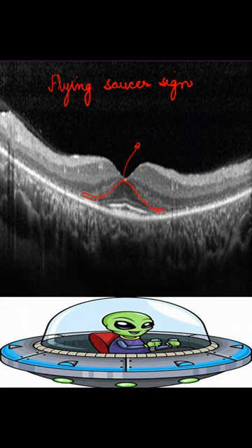Similarly, the external limiting membrane is present just in the center, and in the parafoveal region it is absent. Similarly, your ellipsoid zone is present in the center but absent in the periphery.